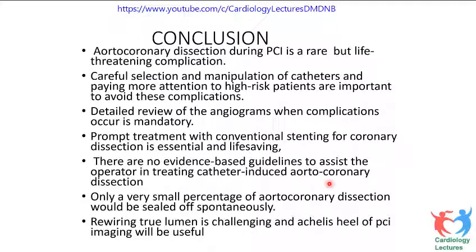Very few coronary dissections heal on their own, especially if the patient is unstable. We cannot leave it. Distal dissections, if the patients are stable, we can leave for spontaneous healing. And always remember, wiring the true lumen is the Achilles heel of PCI in patients with dissection. If you wire the true lumen, the job is done. The rest is very, very easy. And imaging will definitely be very, very useful for you.